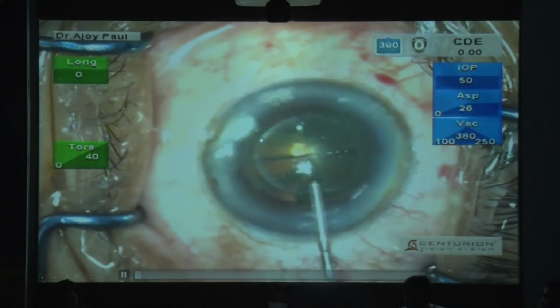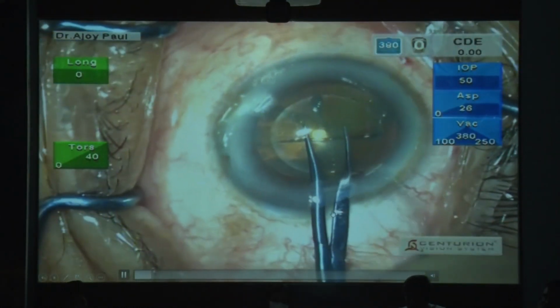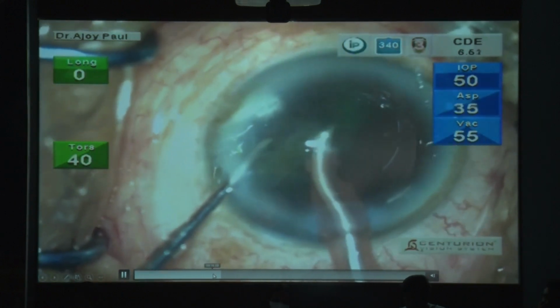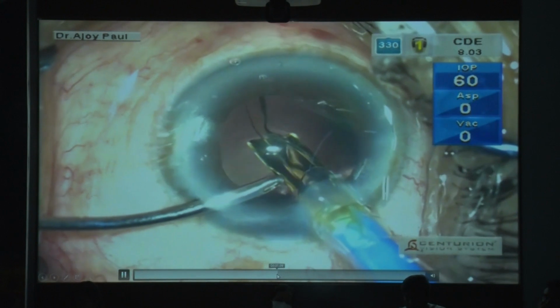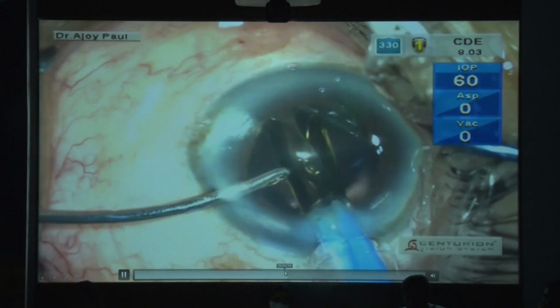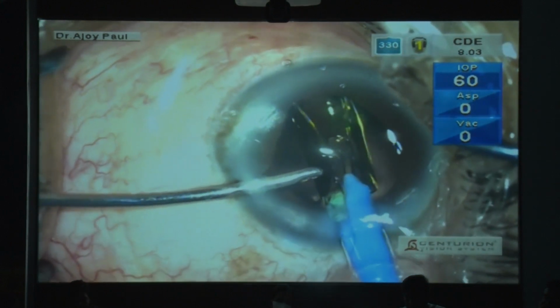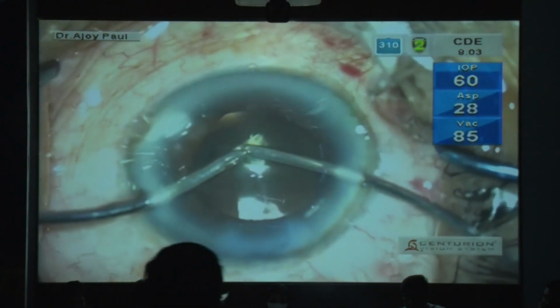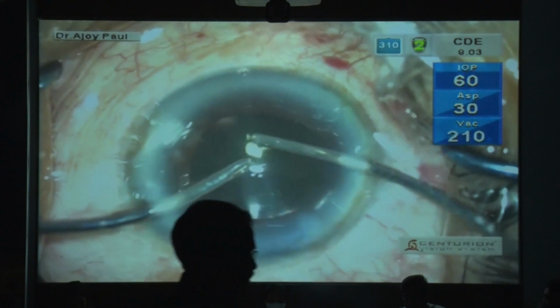Look at this. These are the two cuts that have come intrastromal, and as you go ahead with the surgery, you can remove it, and at the end of the surgery. In these cases, basically, we do up to 1 diopter. If it is above 1 diopter, we would definitely go for toric lenses.